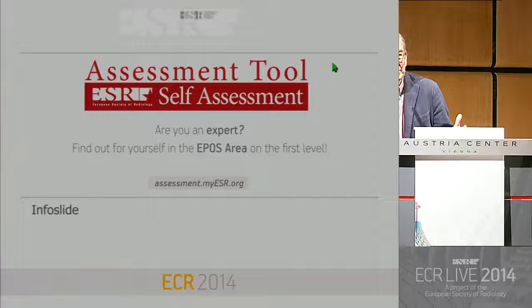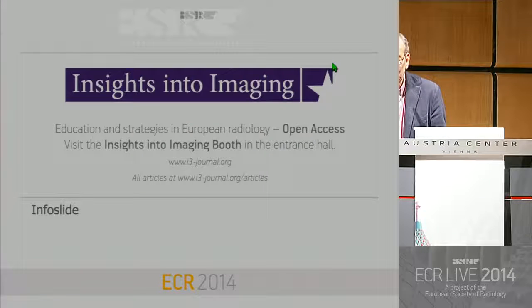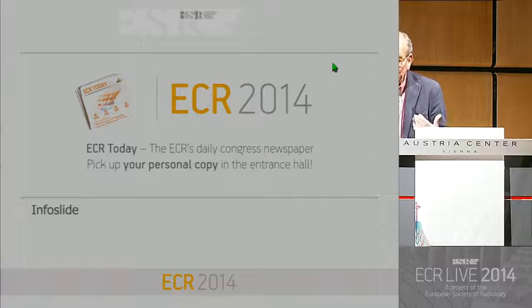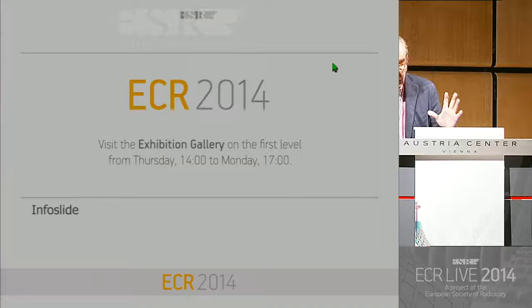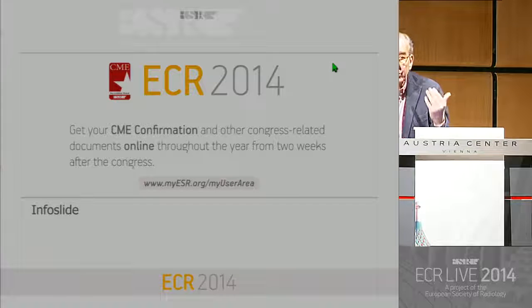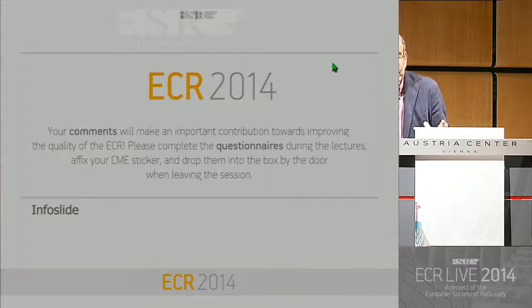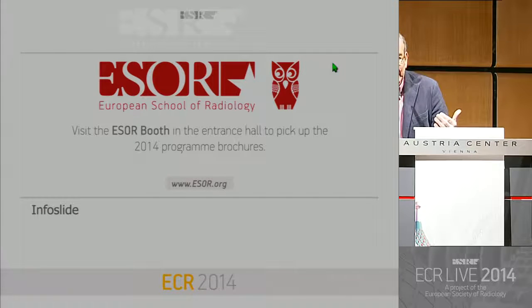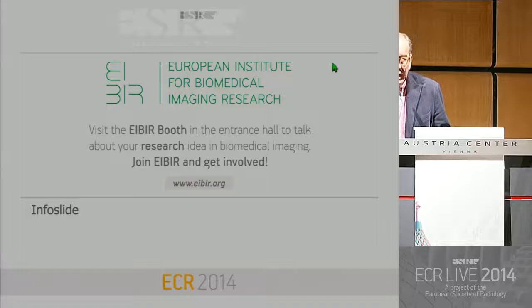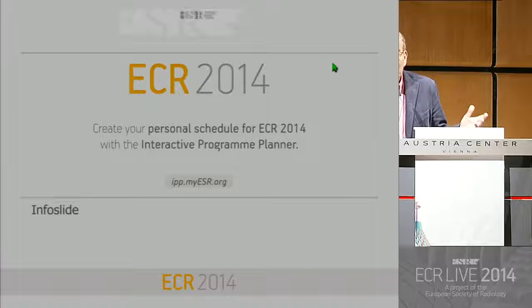It's confusing sometimes. It doesn't add, and in a detection protocol, we also now use the examination without the rectal coil, which Eddie didn't say, but at 3T, it's probably possible in this routine protocol, and even at 1.5, if you take your precautions, if you prepare the rectum properly, if you add some excitations, and if you use a multi-element pelvic coil, you can. You can do a good detection with T2 and diffusion.